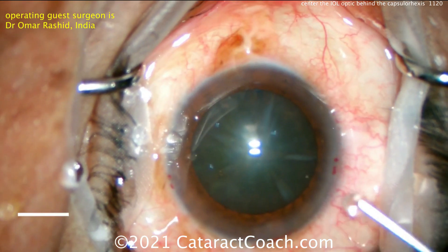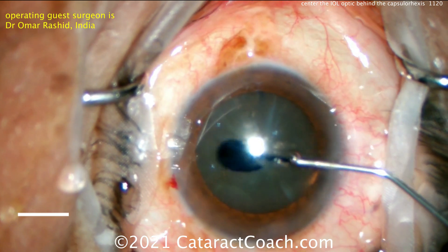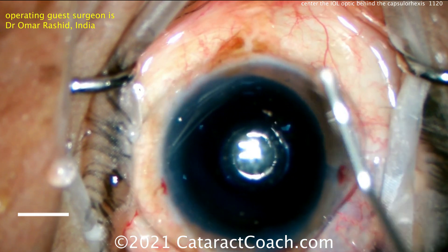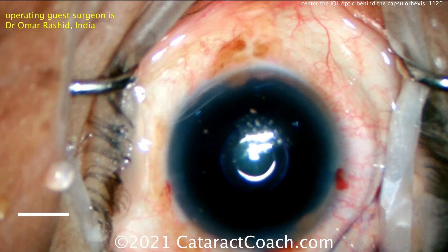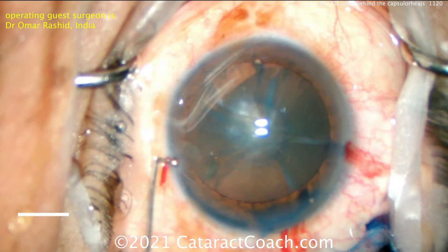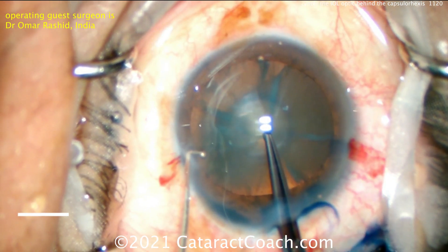Let's see the capsulorhexis. Looks like some TriPan blue dye going inside the eye. Viscoelastic going on top of the cornea — that's very thin viscoelastic, probably HPMC, hydroxypropyl methylcellulose. That coats the cornea very easily. There's the OVD going inside the anterior chamber. And now we see we have good staining and a pretty good red reflex too.